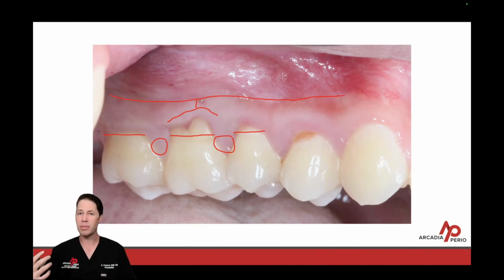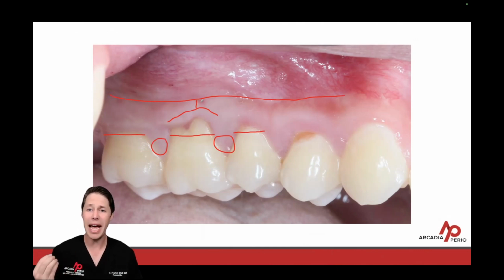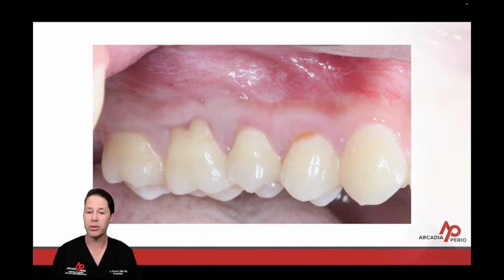So these are all things to be mindful of in terms of how much attached tissue is there and how much attached tissue is needed for gingival health. So the goal of therapy for this case is twofold. I want to gain root coverage and I want to increase the gingival thickness from an average biotype to thick. So I'm going to gain more attached tissue, and I'm going to gain some root coverage on this case, if not 100%. But let's look at this case and let's look at my incision design for this one tooth mucogingival defect on tooth number 3.